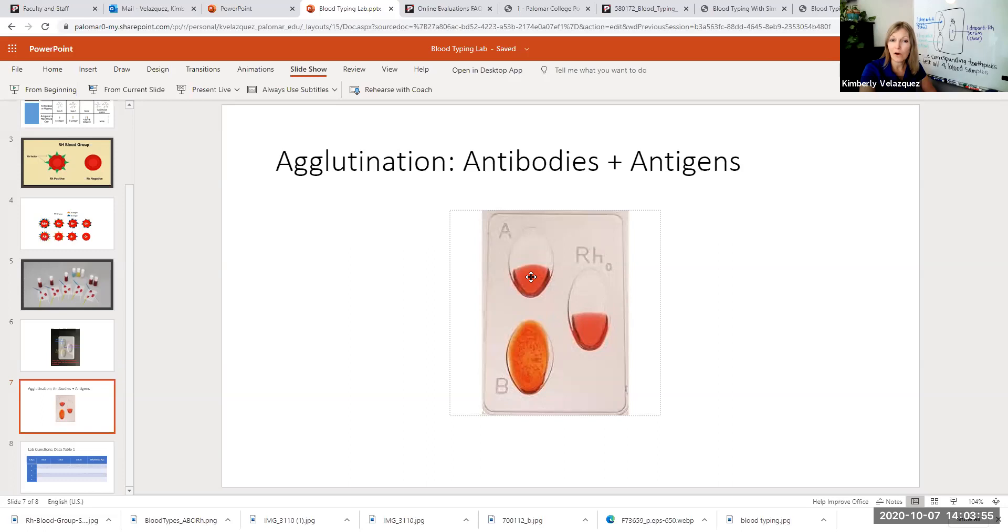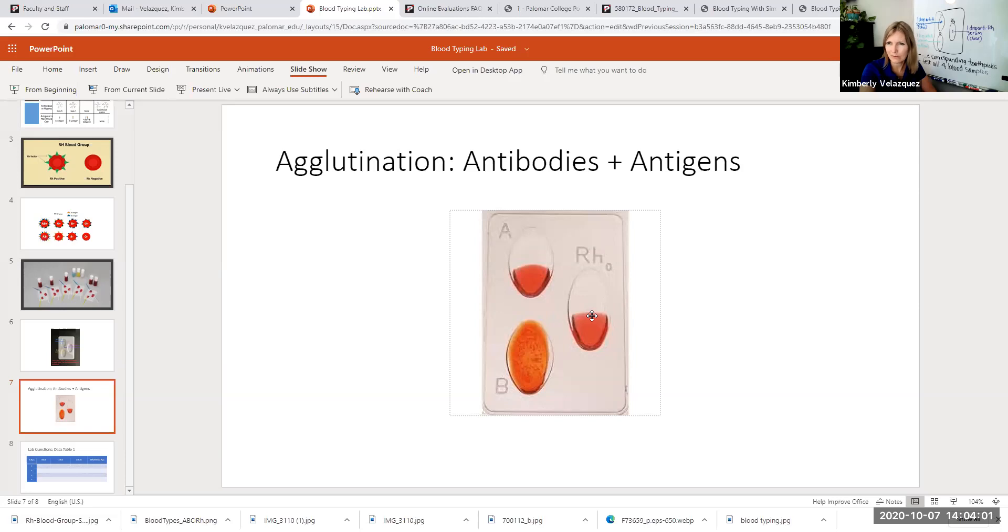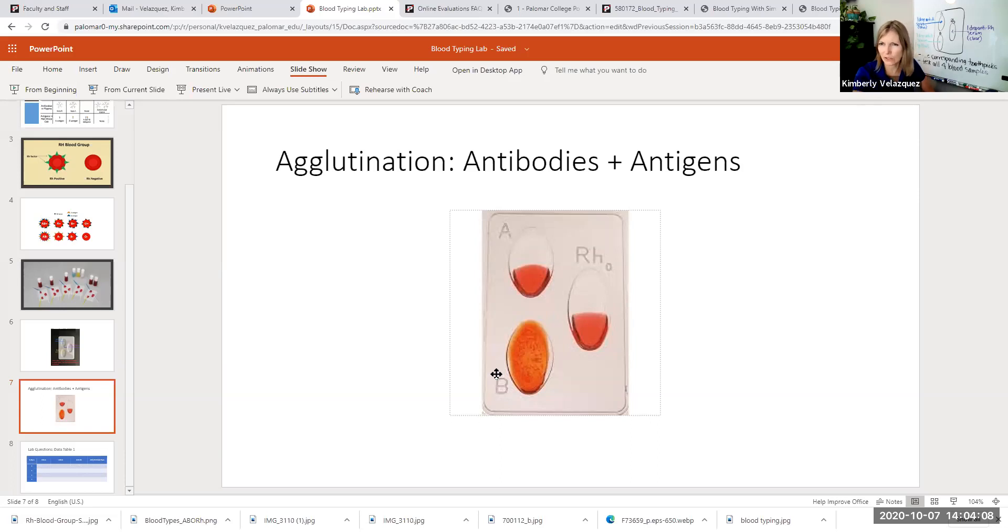If all three had clumped, that would be AB positive. If none of them clumped, it would be O negative. So if you have any questions about that, be sure to ask your instructor.